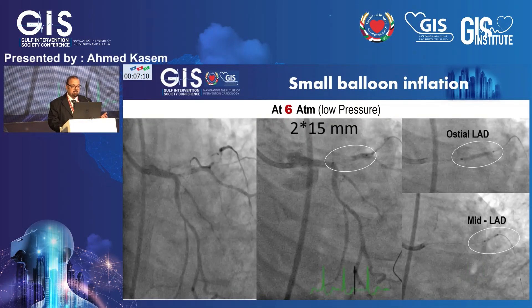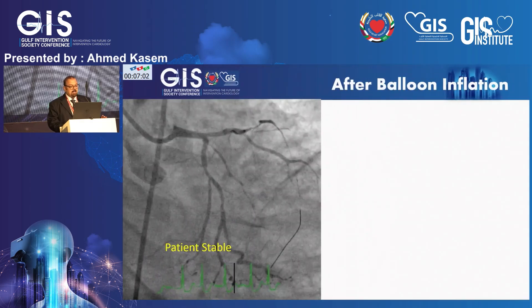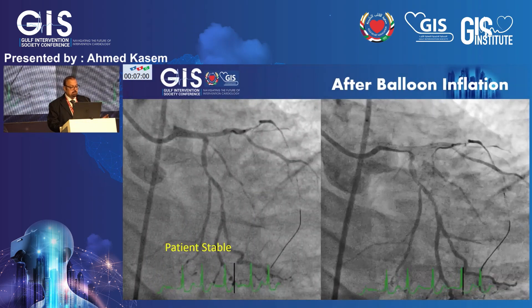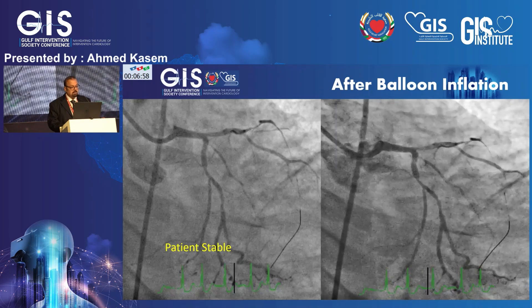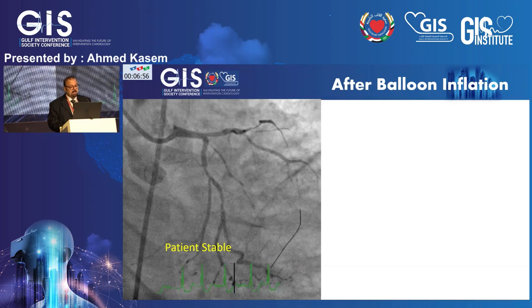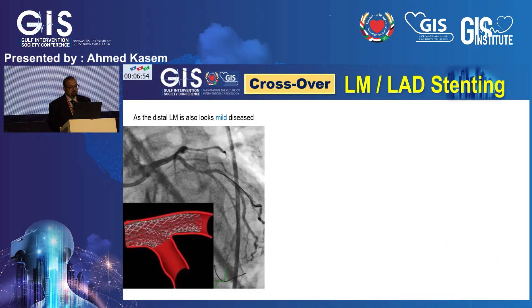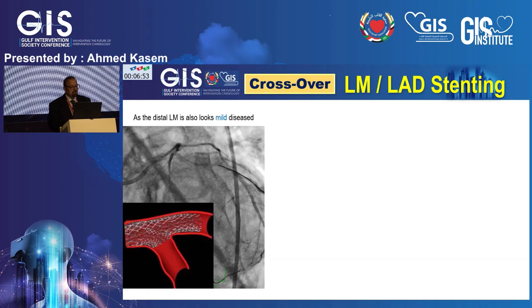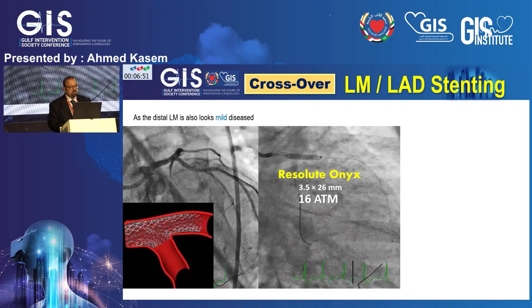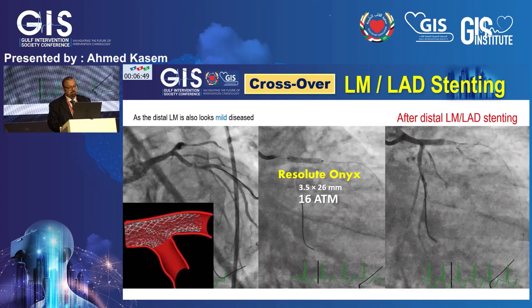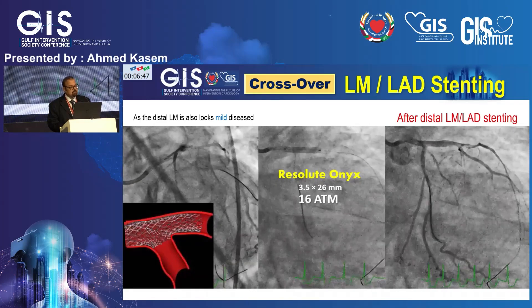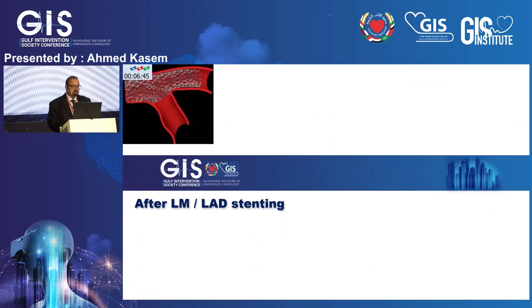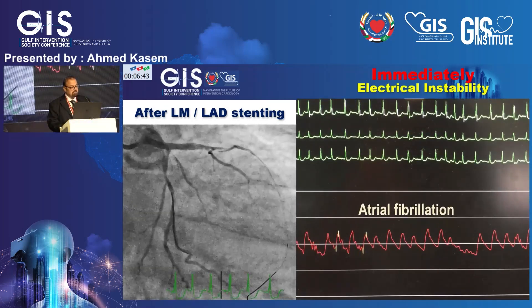Given the tight underlying lesion, I decided to use a small balloon at low atmospheric pressure — only 6 atmospheres. After ballooning, the patient was stable with improvement of lesion severity. I decided to proceed with stenting, deploying a 3.5×26 mm stent to the distal left main at 16 atmospheres.